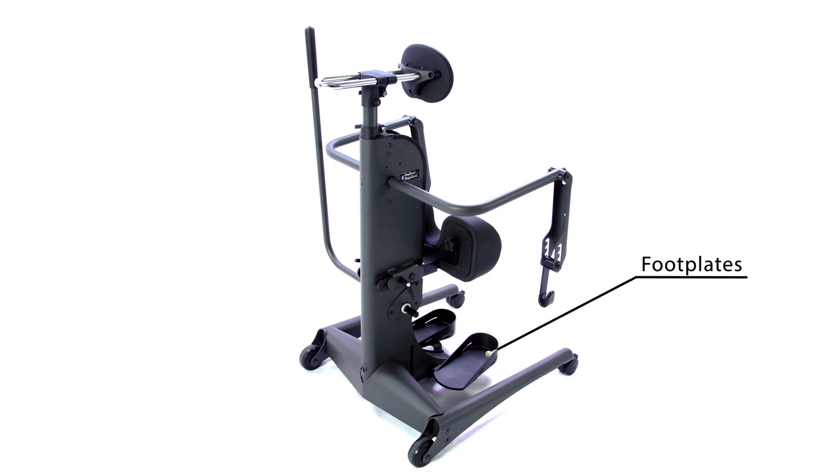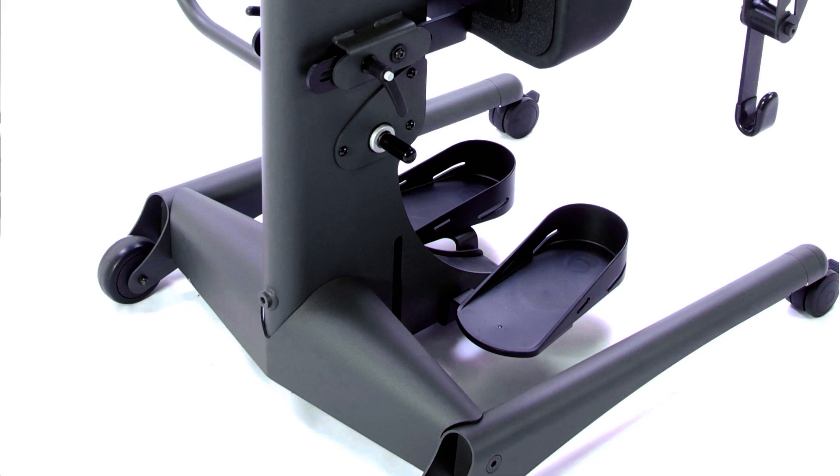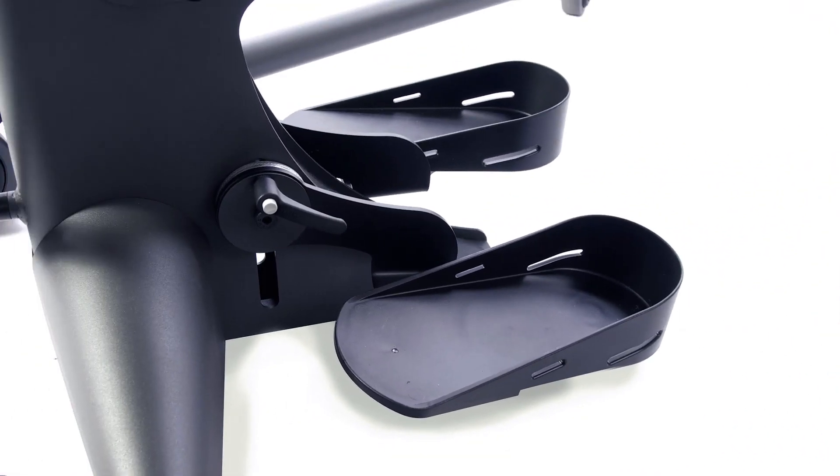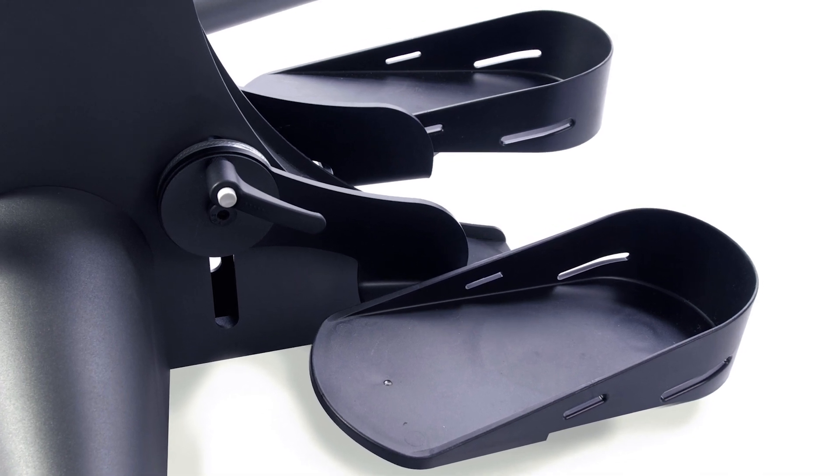The EZ-Stand Strap Stand Base Unit comes with non-adjustable footplates. The optional adjustable footplates allow independent height, plantarflexion, and toe-out adjustment.